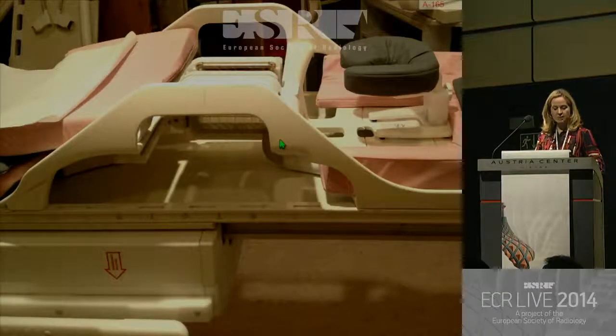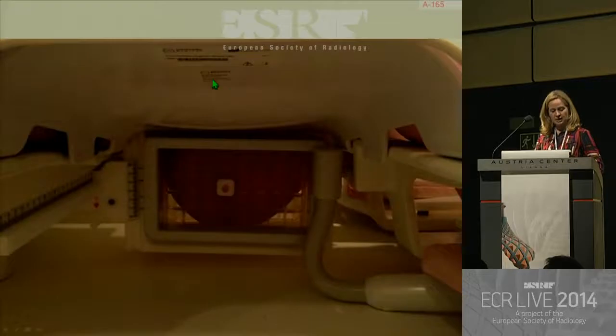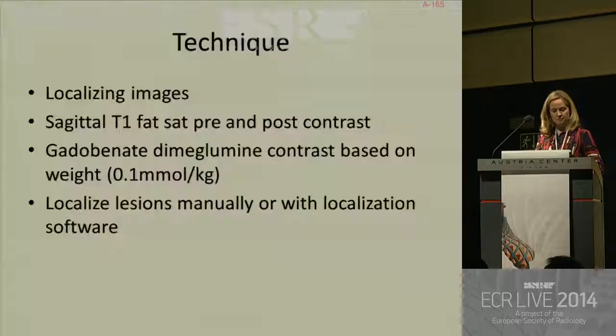And here is our breast biopsy coil set up for a medial breast approach. You can see a plate here, and the contralateral breast sits on the plate, keeping it out of the way. Here's the breast in position, pulled deeply into the breast coil. We have the grid here, and the fiducial is sitting within one of the squares in the grid, and this helps with triangulation of the lesion.